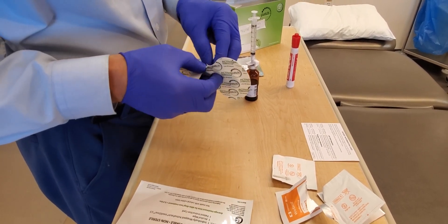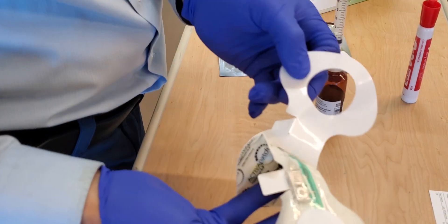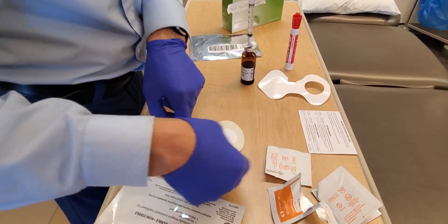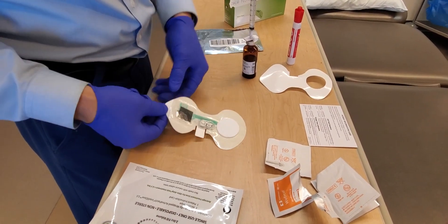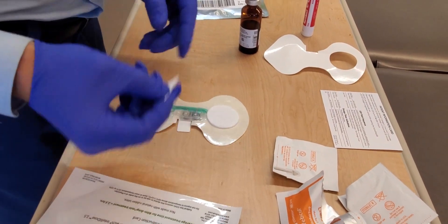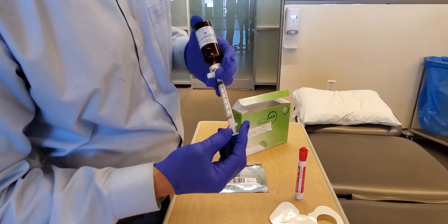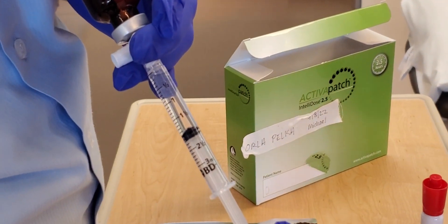You have this adhesive that's easier to pull off prior to the medication being administered to the pad. You have two additional little tabs. We'll leave one on because it'll be helpful in a moment. Then we're going to flip our bottle over and pull it down to where it says two milliliters, just like that.